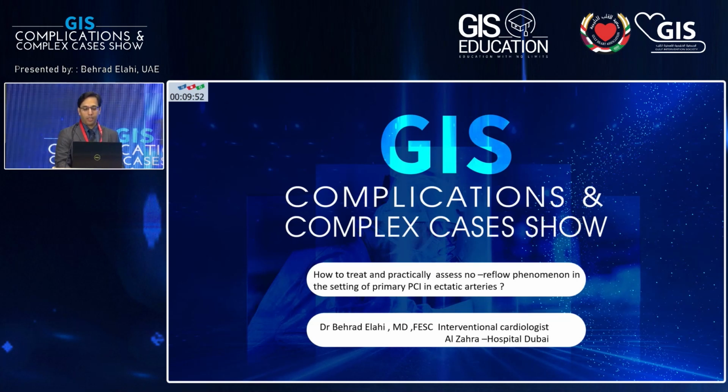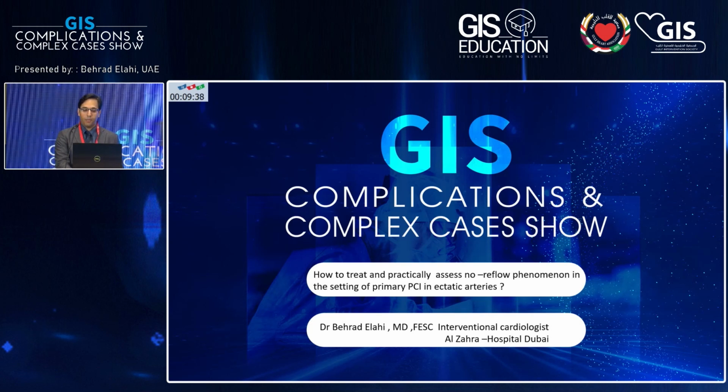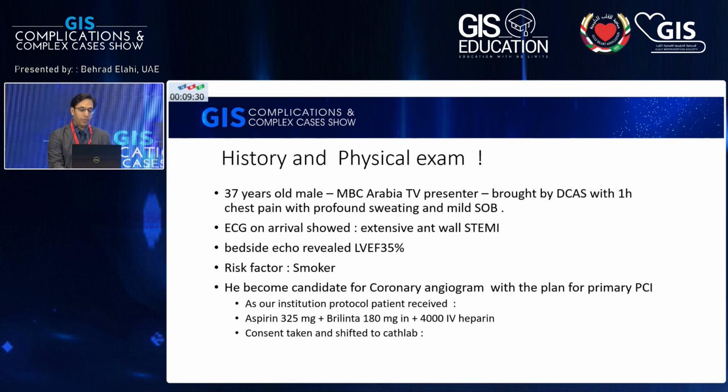This is about how to treat practically the no-reflow phenomenon in the setting of the primary PCI. As you see, in these 2 days, we have seen so many cases of the mechanical complication of the intervention. And of course, for the mechanical complication, we have a mechanical treatment. But the no-reflow phenomenon is a physiologic complication of the intervention, and the treatment is more sophisticated than the mechanical complication. Here I go to the case.